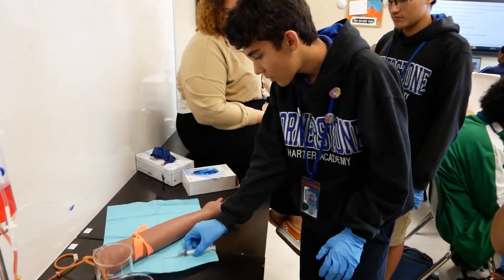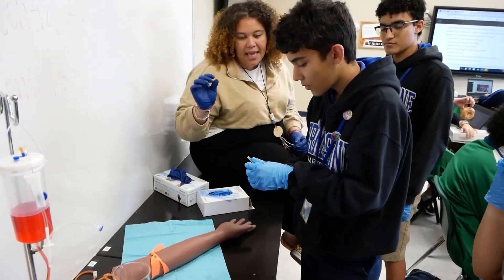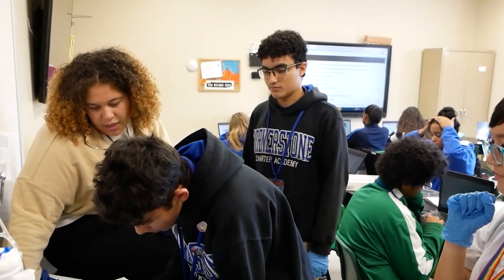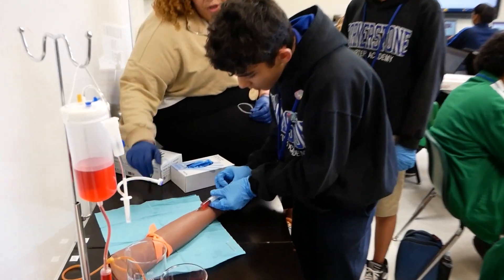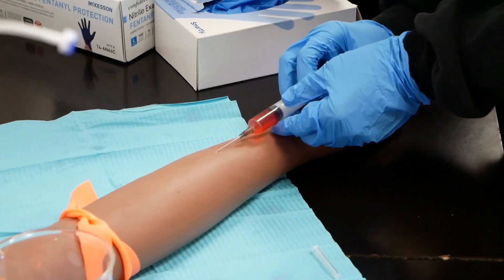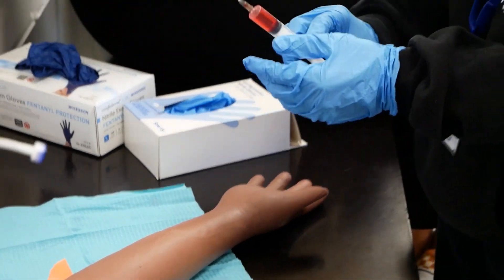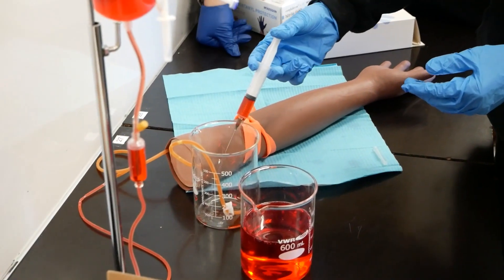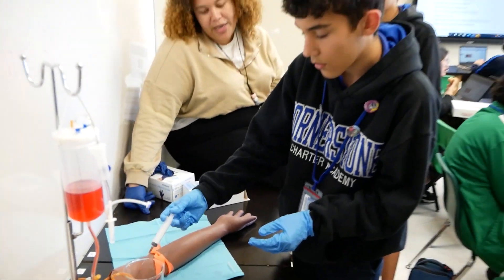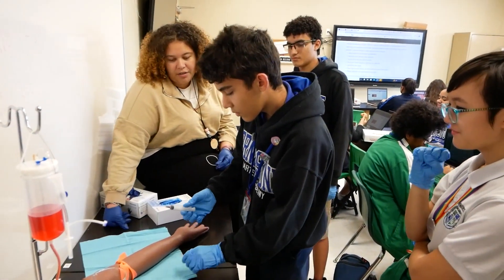When you're ready, pick up your needle, take off the cap, and set the cap down — but the needle will stay in your hand. Then when you're ready, gently back the needle all the way out and pick up your hand so we're not tugging on the skin. Then recap the needle — pick up your cap and cover it.